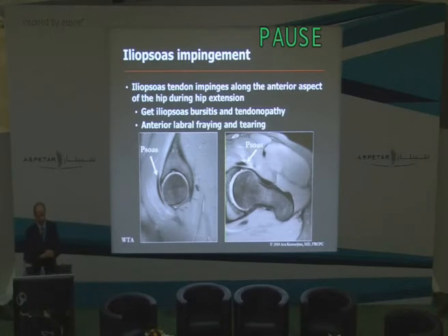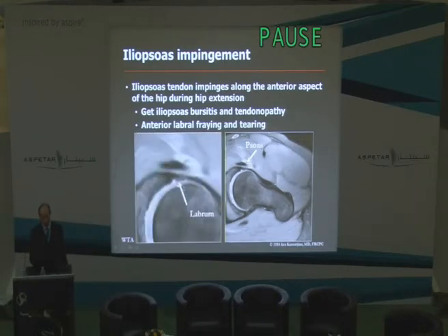And what we look for in these is on the sagittal and oblique axial fat-suppressed proton density images, you can see how this iliopsoas tendon is very closely associated with the anterior capsule and the anterior labrum. This is the labrum here, you have the capsule there. Here's the iliopsoas tendon. It's actually the two components you can see here that were mentioned earlier. Oftentimes we see three. You can see edema around that tendon. If we magnify, you can actually see that there's increased signal in the labrum. There's an actual labral tear, but it's getting crushed and degenerated. And that's what they see at arthroscopy as well. They often see a frayed labrum, a degenerated labrum, as opposed to those classic labral tears that you see in other types of impingement.